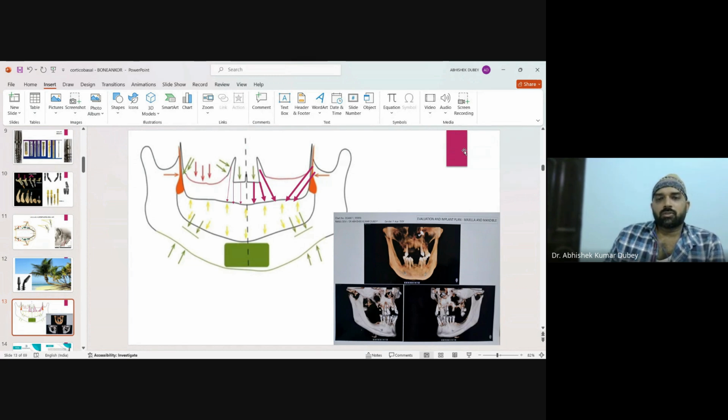Okay. So what you need to do is you need to take a wider diameter implant, 5.5 or 7, something like that. And once you have extracted it, you have the tooth in your hand, you take a probe or a scale, you measure the length of the root of the premolar which you have extracted, okay, and you insert a wider diameter implant of corresponding length. You will never injure the mental nerve.